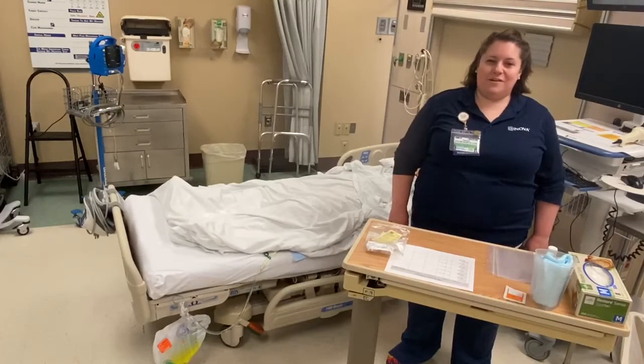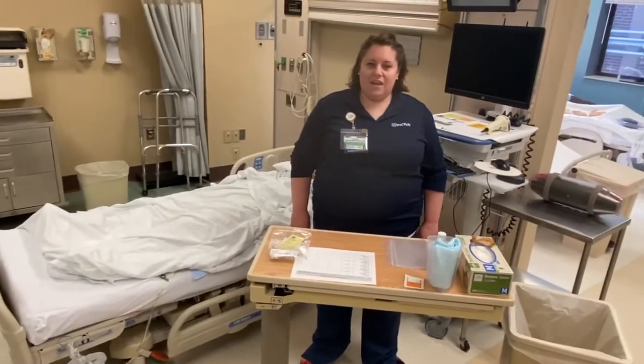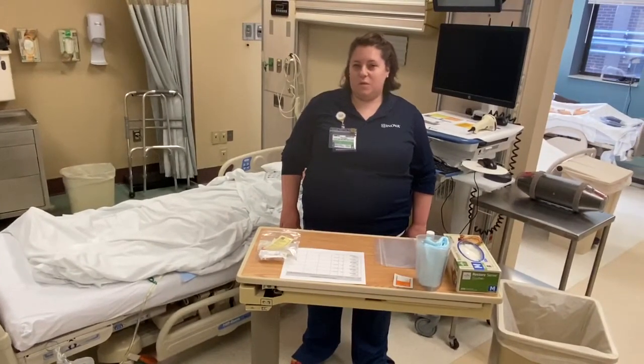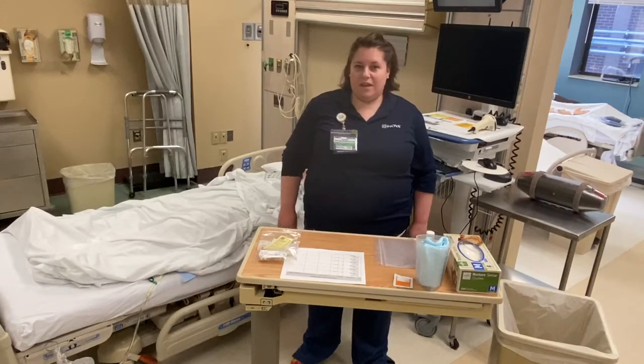Welcome to the video on specimen collection, taking urine from a Foley catheter. In this video, I'm going to show you the methods we use to obtain a sample of urine when your patient has an indwelling Foley catheter.